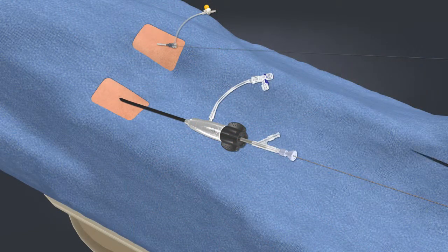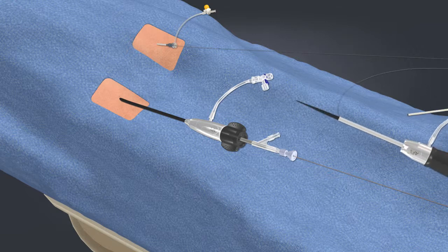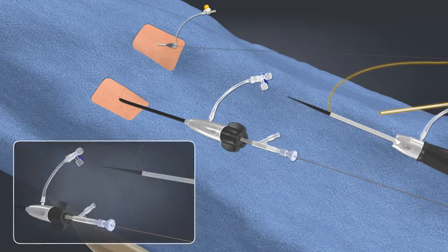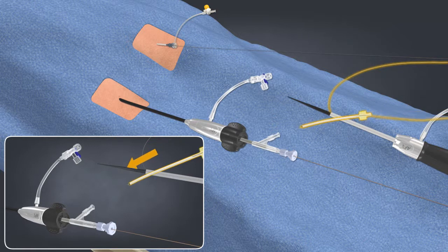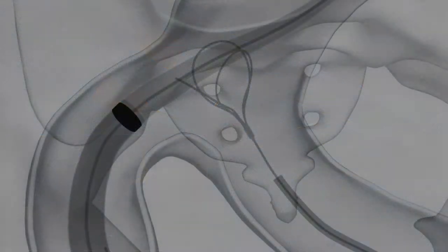Place the bifurcated delivery system on the sterile field. Bring the wire guide to the tip of the contralateral limb wire and insert the wire through the Y connector of the dilator. Continue feeding the wire through the wire guide until it exits the tip of the dilator.